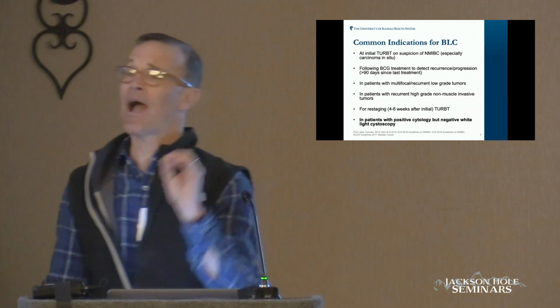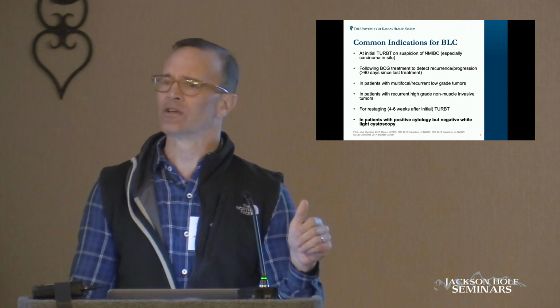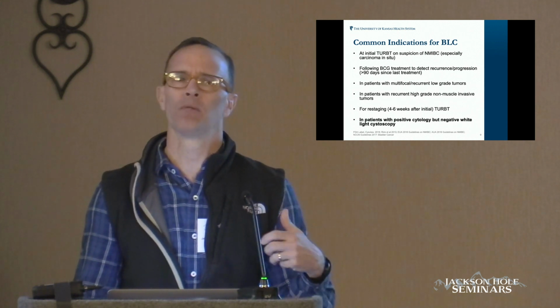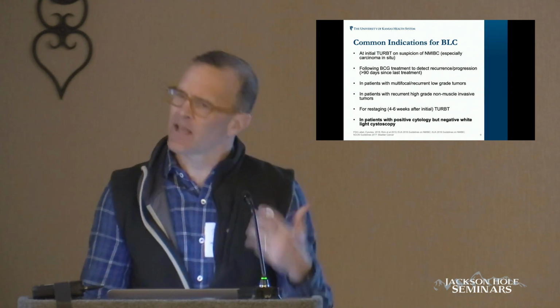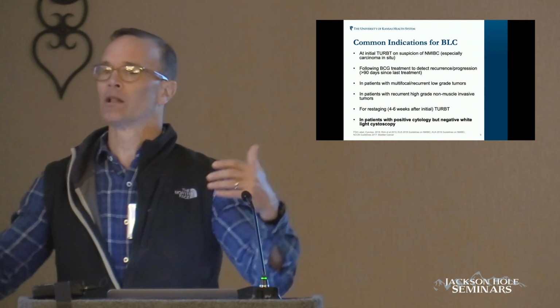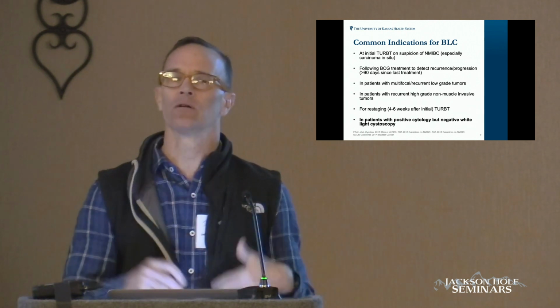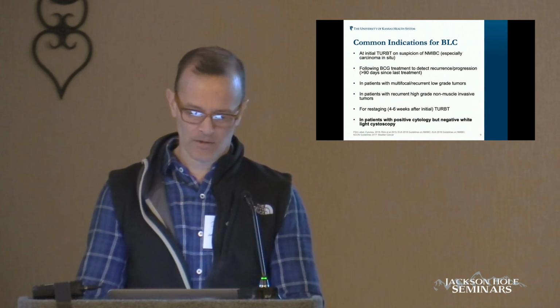I will say after BCG, and I'll cover this in a slide, it is a little challenging. Sometimes there's a lot of inflammation in the bladder and it lights up, and it can be a little bit challenging. Some of that is just utilizing it a lot. You get this sort of learning curve. You sort of learn what's real and what's not real. So that can be a little bit challenging.